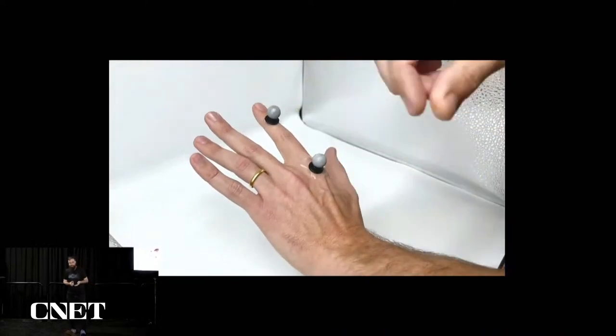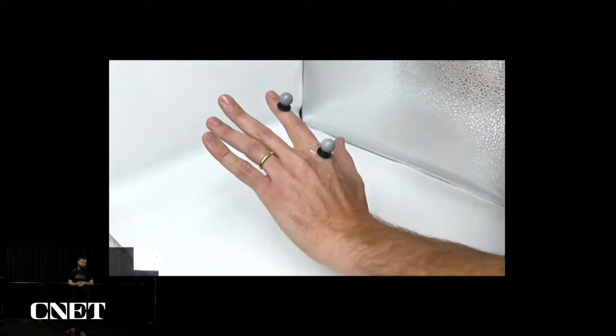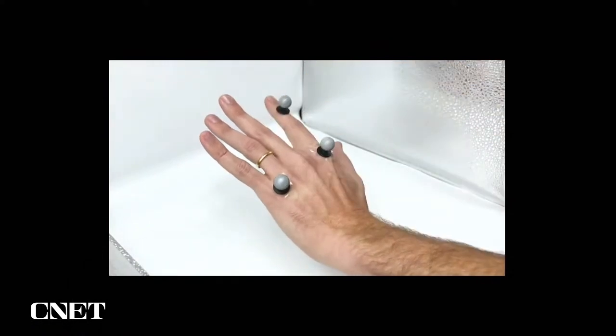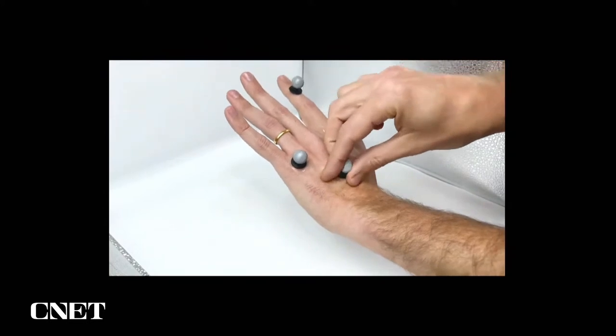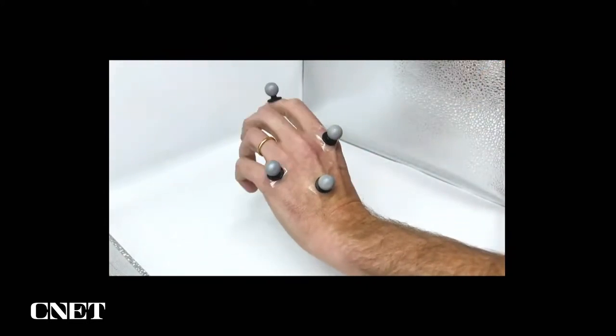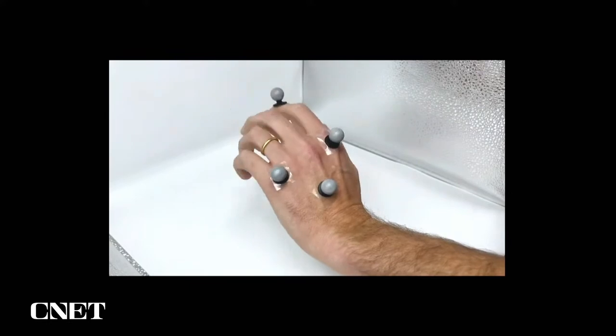Now, to track movement, it's very common to use motion capture markers, like you might see in the production of a movie. These can be placed with a light adhesive, and you can see me placing these on my hand. We're going to use these markers to let us zoom in on movement in the next couple of slides.